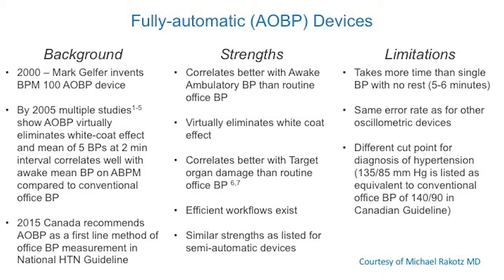BP True, for example, may take 5 or 6 readings, one to settle the cuff and then one at a minute or 2 intervals. It has errors, and the issue here is that the cuff size matters on an oscillometric the same as it matters on an aneroid. So you can't get away with just using the one size that maybe is connected to your Dynamap or your Omron or whatever.